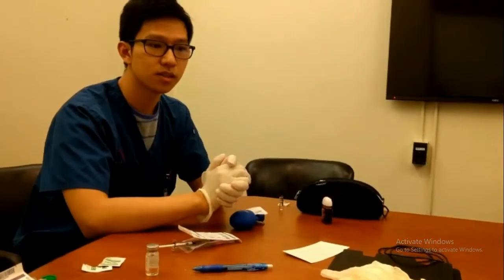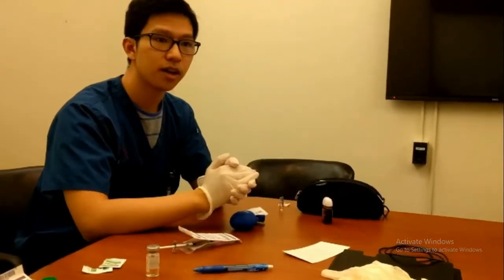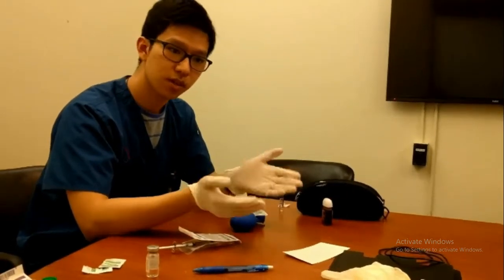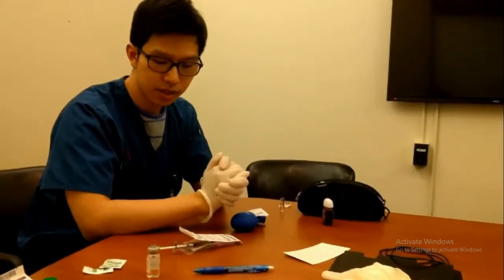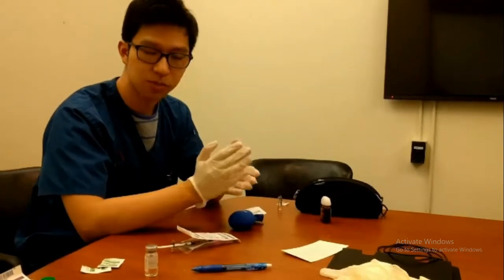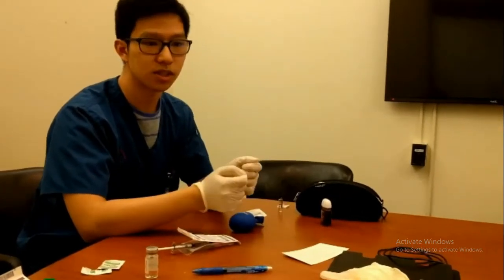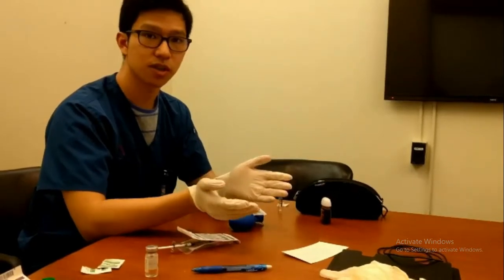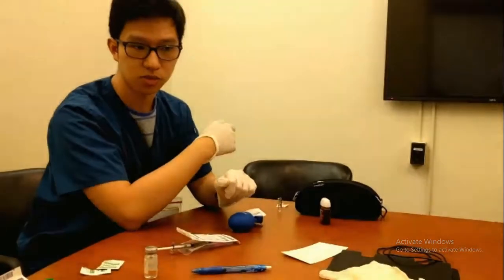I will also be explaining the procedure to the client. I will be saying, okay, so Mr. Mancini, we're going to be doing your subcutaneous heparin and also your intramuscular Haldol today. So for your subcutaneous heparin, we'll be injecting it into your abdomen, and also for your intramuscular Haldol, we'll be injecting it into your deltoid.